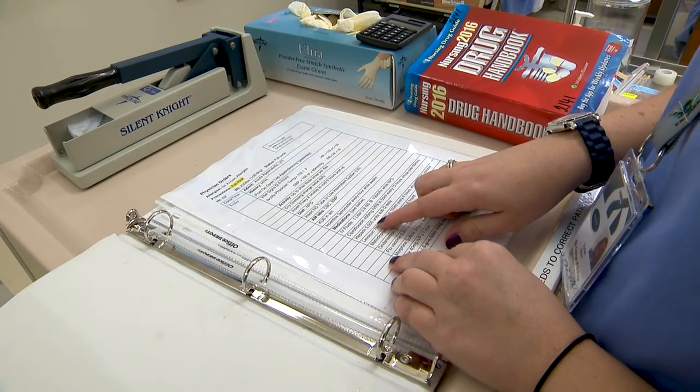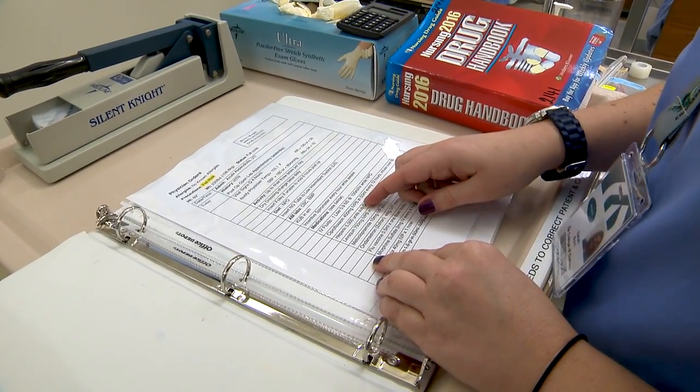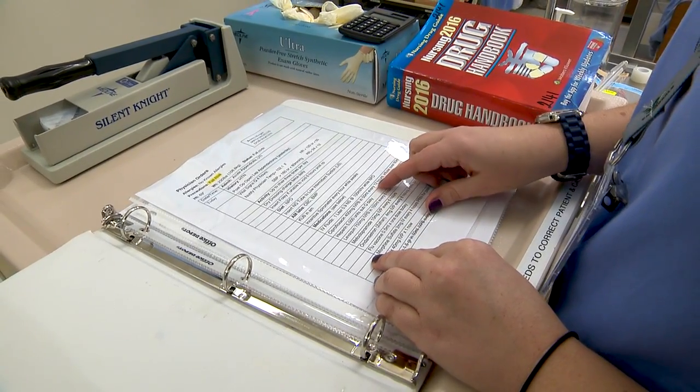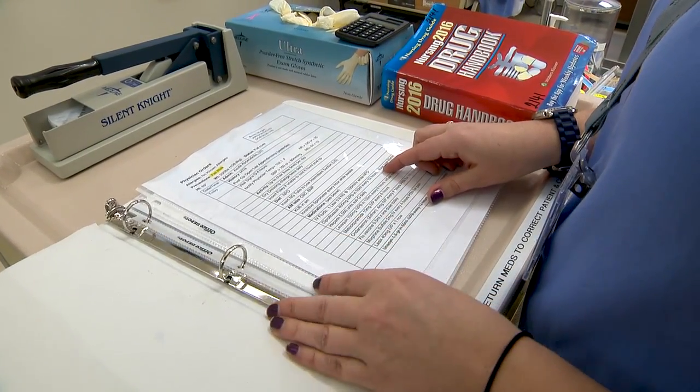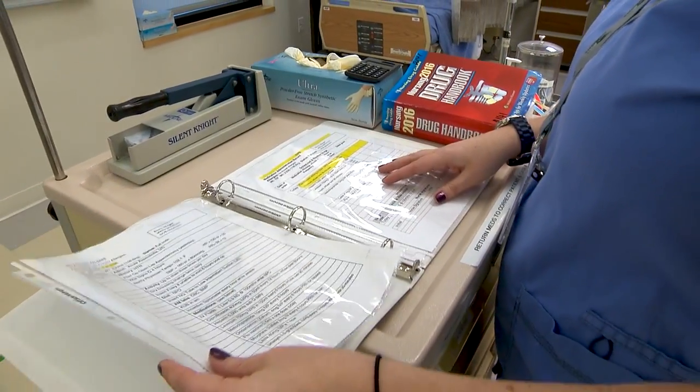And I see here he has an order for ciprofloxacin 400 milligrams IV piggyback in 50 mLs every 12 hours to infuse over 60 minutes. Now I'm going to compare my physician order to my MAR.